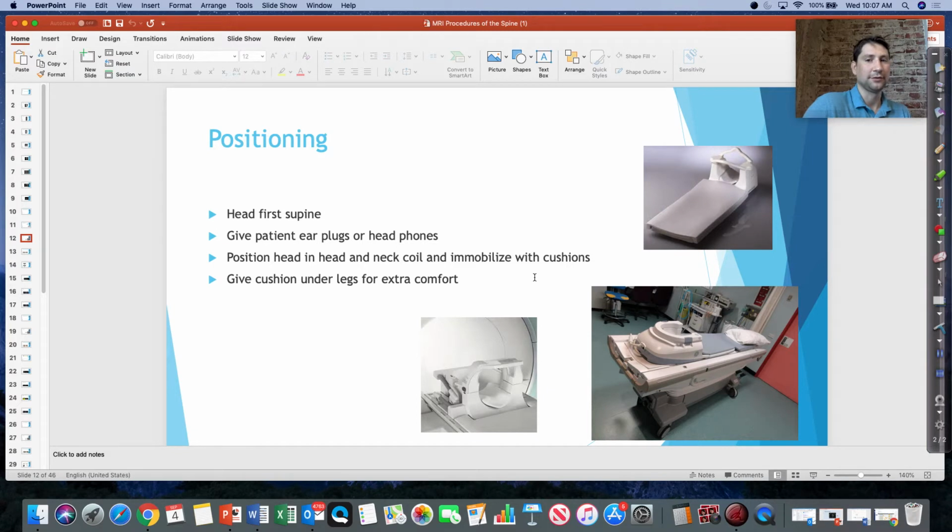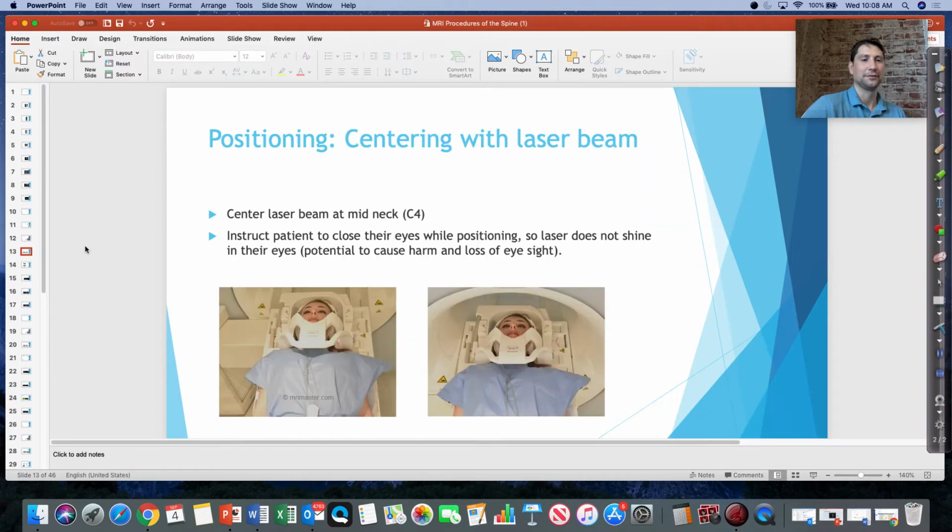And then these are the coils that we're going to be using. So here is a Siemens coil where we have the coils built in within the table. So we have our phased array coils already built in the table, but then you have to apply your C-spine coil. You can put the anterior part on if you want. And then you have your GE coils. This is an older GE spine coil. I think they still use that at E-Wash every once in a while. And then this is a newer phased array GE spine coil. It's kind of a pain because you have to take this off and put it back on. If you've been at these sites and how many times you do that throughout the day, it can be kind of exhausting with how heavy that is. So Siemens is pretty nice in that you don't have to constantly take things off and put them back on.